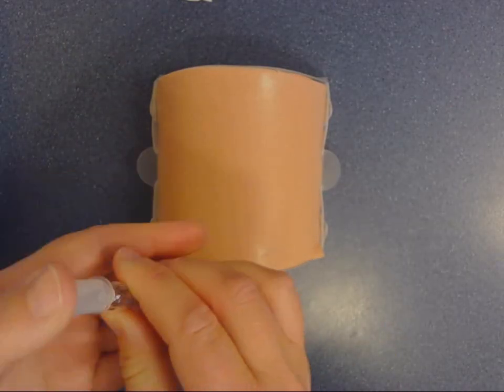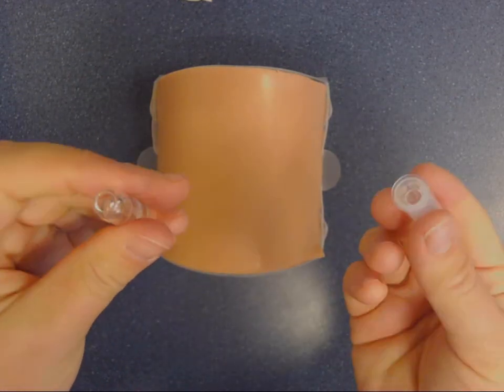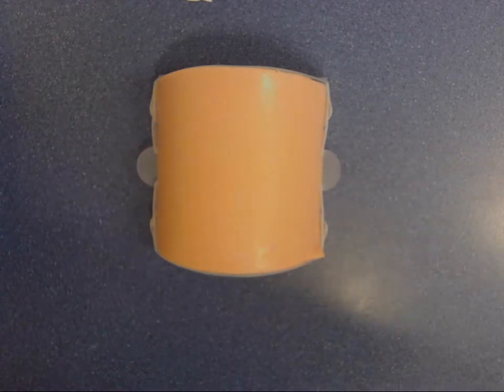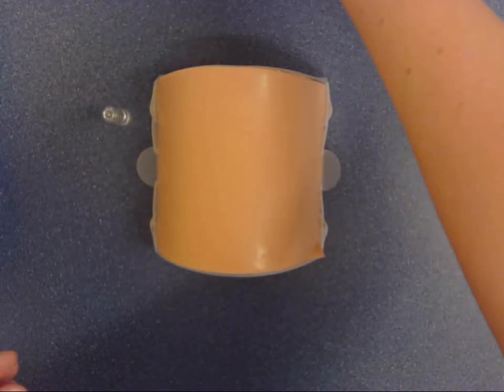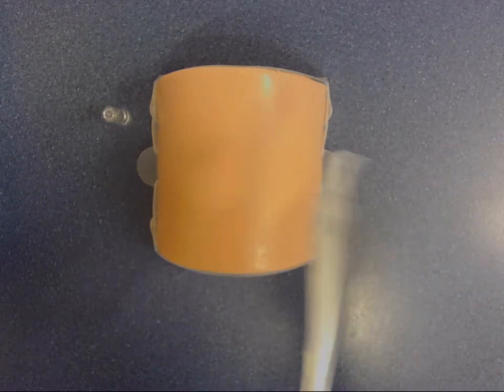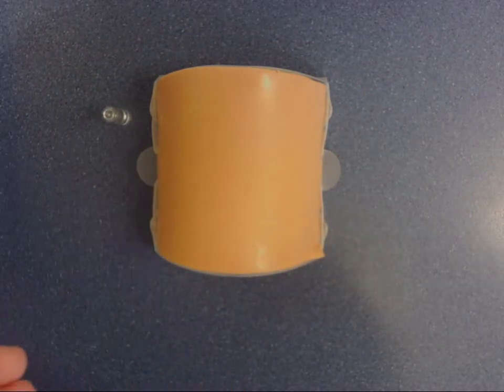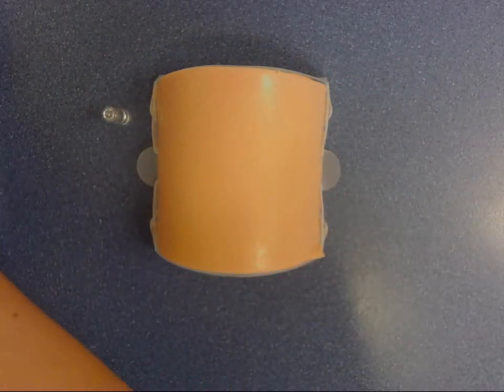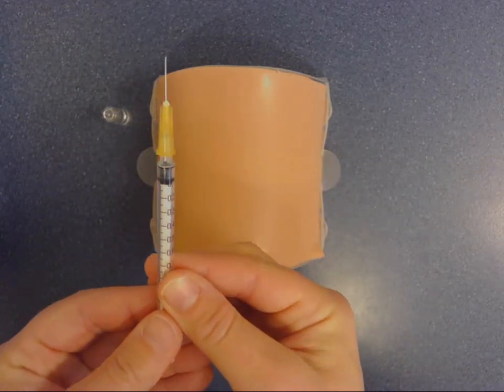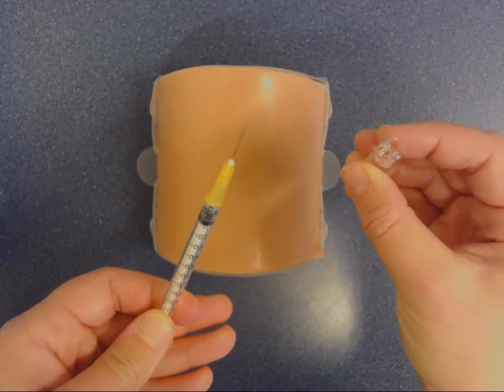I'm just going to prep the drug. Snap the top off with an ampoule snapper. Pop that in the sharps bin. I've got my one mil syringe. I've got my needle that I've just opened. And I'm going to draw up my drug.